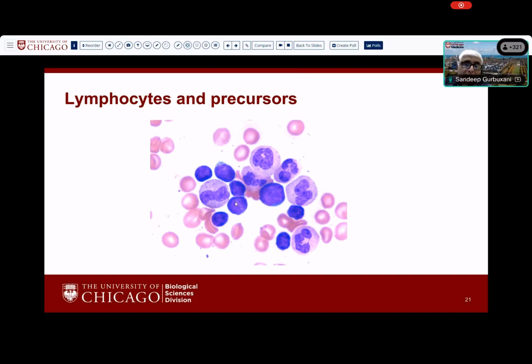What helps in distinguishing the cell even morphologically from a blast is the environment it is present in. So you have this larger lymphoid cell here with very uniformly dispersed chromatin, almost blast-like, and you can see within the same field there's a progression. So you have a smaller cell, still with fairly open chromatin, not quite as condensed, and then you have a little bit of a spectrum of maturation here.